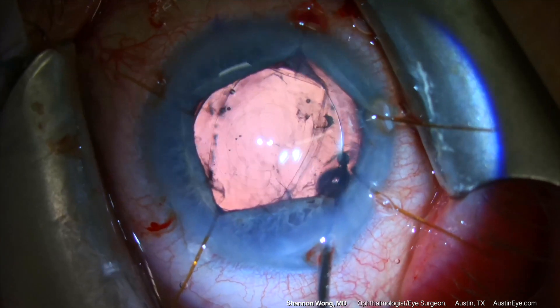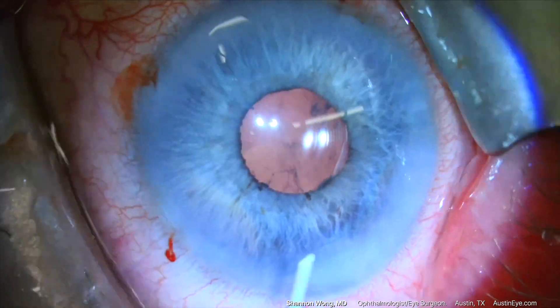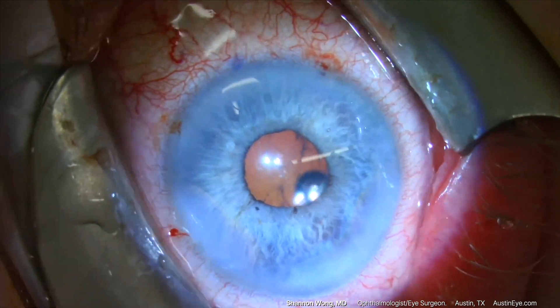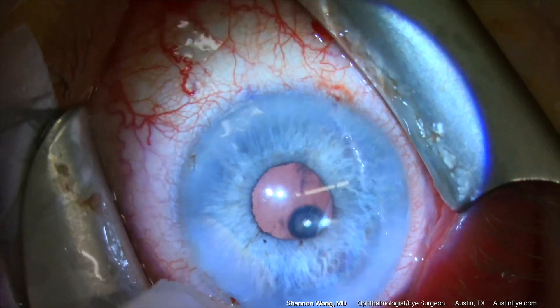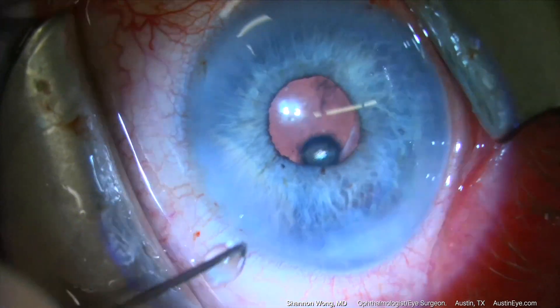Once the replacement single-piece acrylic lens is in reverse optic capture and the IOL is deemed to be centered and stable, the viscoelastic is removed from the eye using BSS flushed through a 27-gauge cannula. Do not perform I/A to remove viscoelastic from the anterior chamber if the IOL is in reverse optic capture and there's no capsular support.